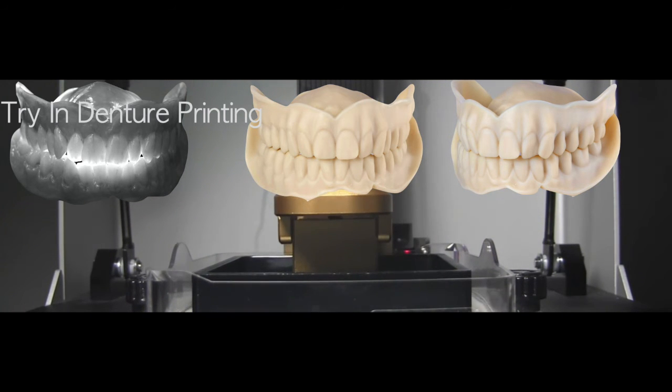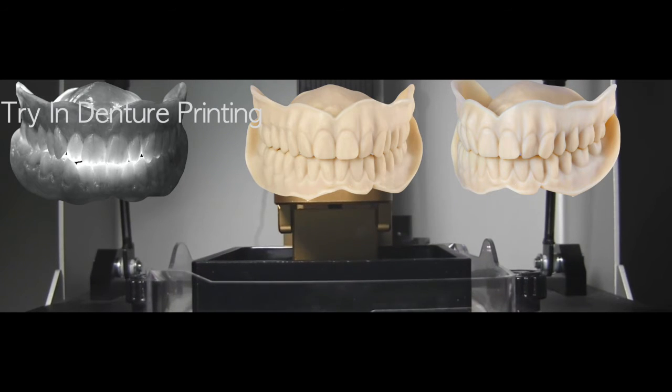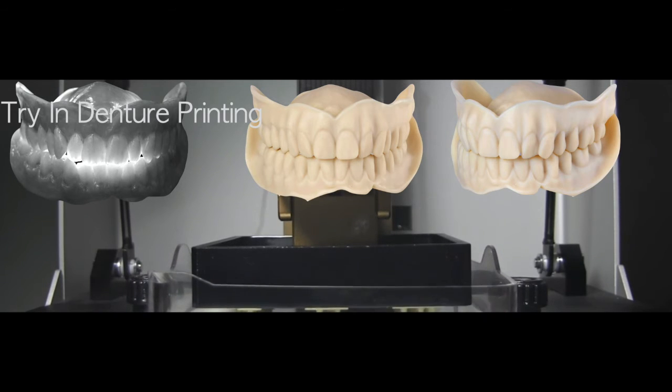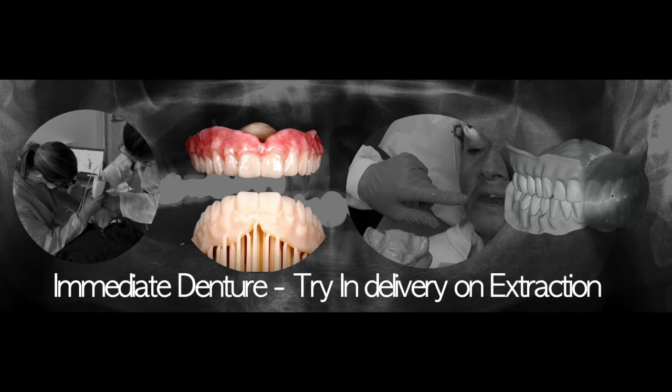Now we're going to print the try-in denture. So try-in dentures, the only difference from the final one is these are in one piece, and also only the teeth color is present, not the gum color. And once you get the try-in, now is try-in delivery on extraction day.